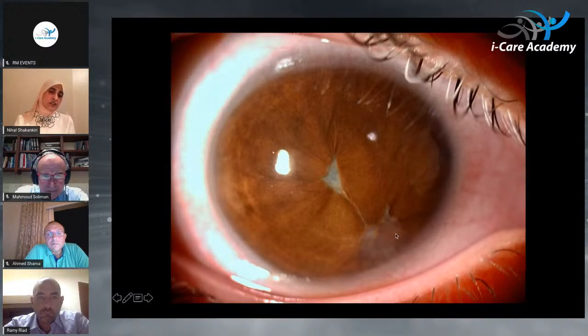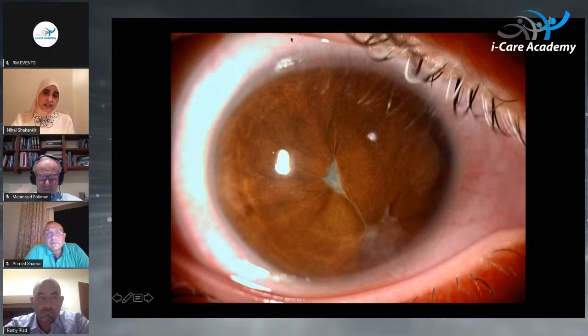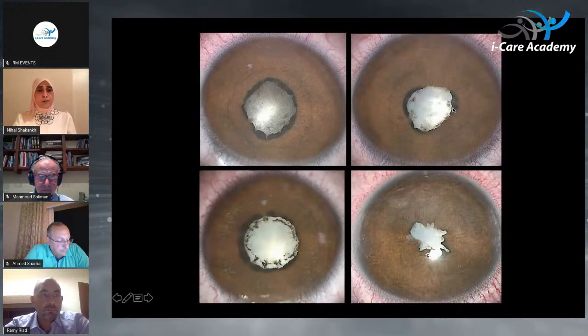Adhesions between the iris and the cornea and total posterior synechia and iris bombé, as here, complicated cataract after Vogt-Koyanagi-Harada. Can you see the poliosis here of the lashes? So when we go for surgery after controlling the inflammation, usually the pupils are undilatable like that.